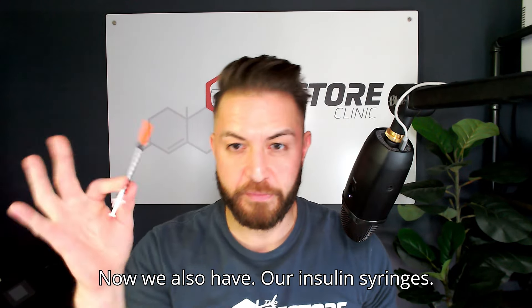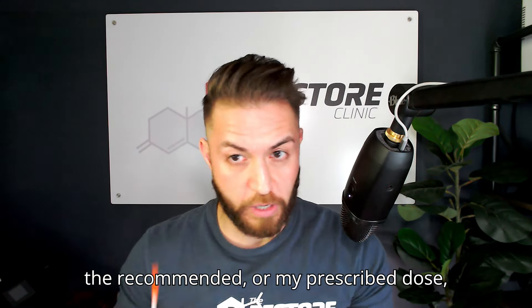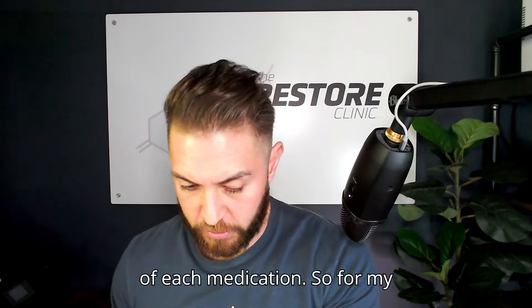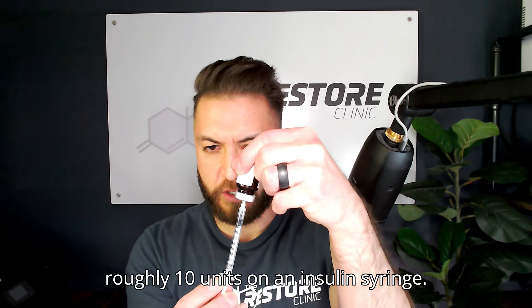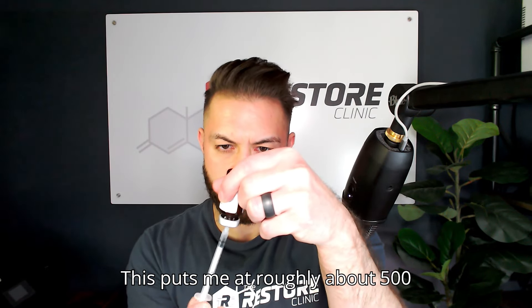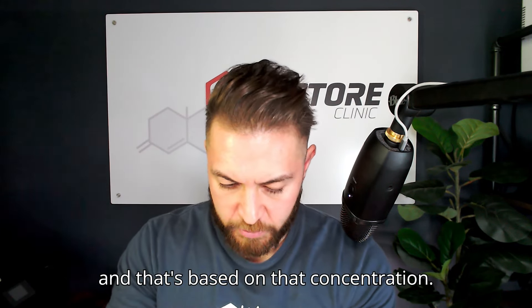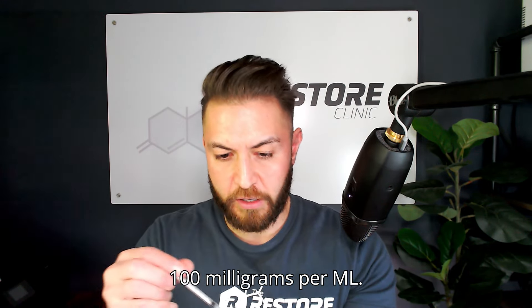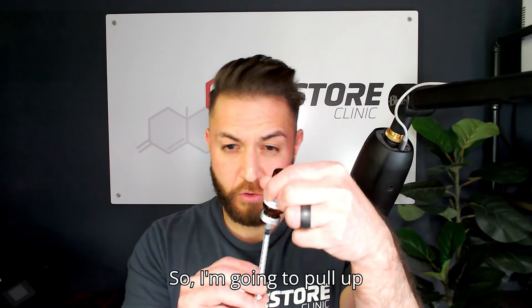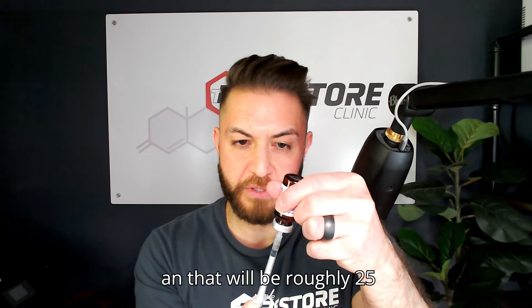We also have our insulin syringes. I'm going to draw up the recommended, or my prescribed, dose of each medication. For my tesamoralin, I'm doing roughly 10 units on an insulin syringe, which puts me at roughly 500 micrograms based on that concentration. For the NAD+, this is 100 milligrams per ml, so I'm going to pull up 25 units, or 0.25 mls, which will be roughly 25 milligrams.